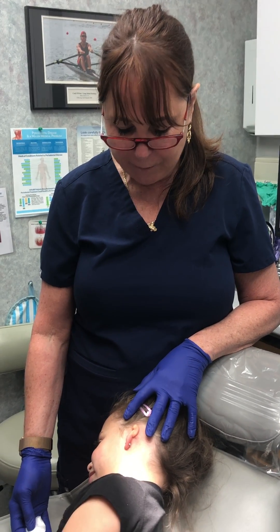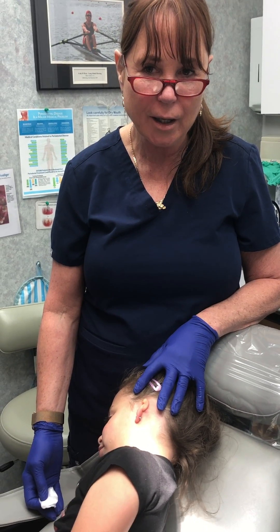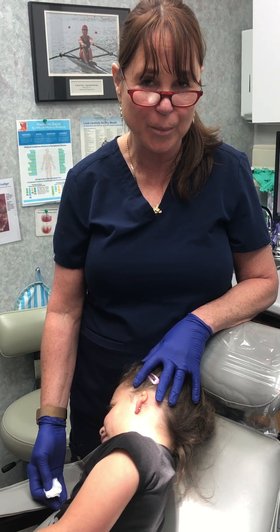Hi, good morning. This is Dr. Vavoda and my sweetest, most adorable patient, S. We're giving her a prosthetic ear — this is her first time with a prosthetic ear.